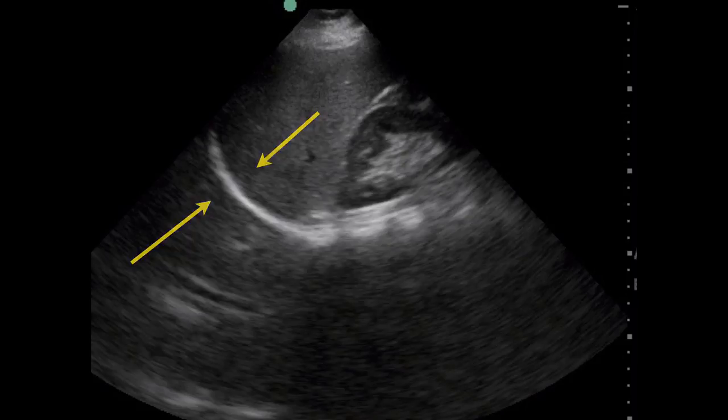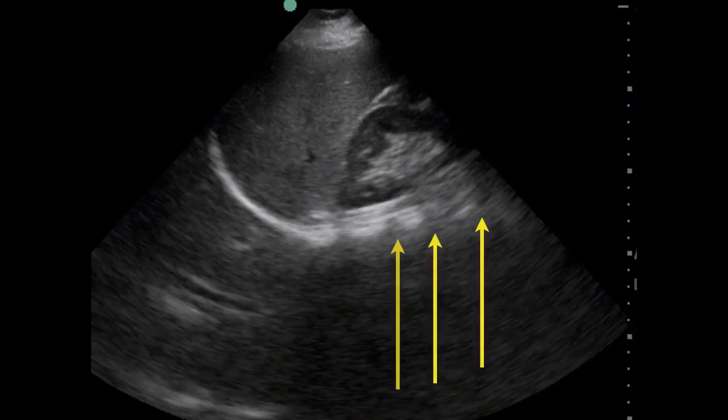The second sign that I want you to look for, which is the one that I actually use more, is something called the spine sign. If you look to see where these arrows are pointing, you see that there's little kind of humps. These humps, as soon as the diaphragm shoots off, they disappear. These little humps represent the vertebral bodies, and obviously in the thorax the patient still has vertebral bodies. However, with an air-filled lung, the sound can't reach the thoracic vertebral bodies, so if the ultrasound machine can't see it, it doesn't know that it exists.